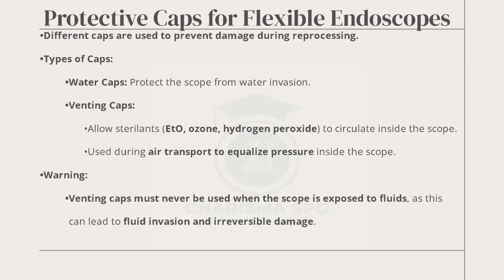Protective caps for flexible endoscopes. So the ports that I talked about, they have caps that come with them.